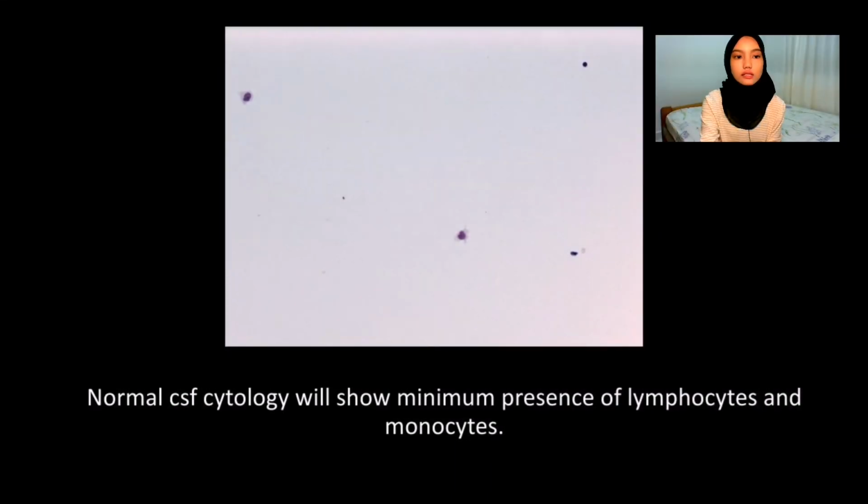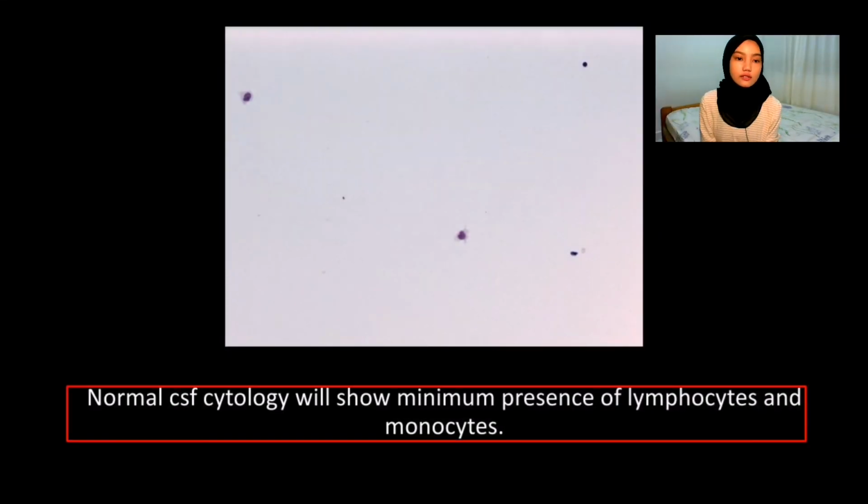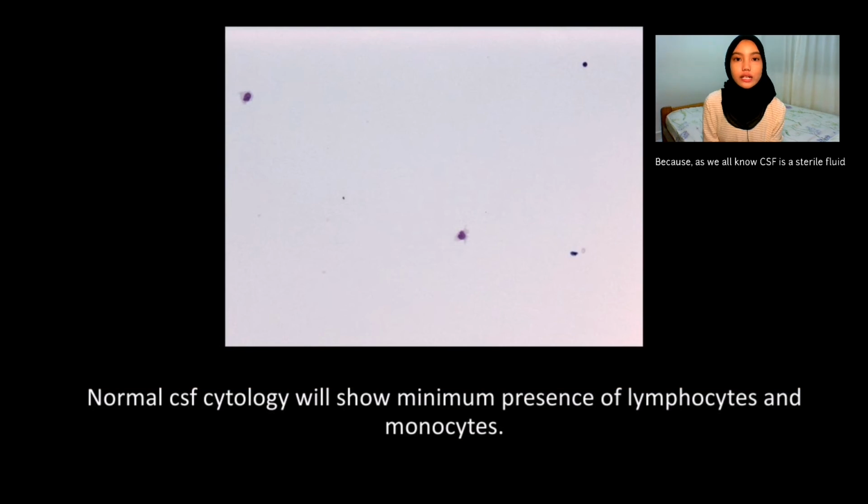So this is the slide. Normal CSF cytology will show minimum presence of lymphocytes and monocytes because, as we all know, CSF is a sterile fluid, so there will be 0 to a minimum presence of cells, white blood cells, epithelial cells, and whatnot.